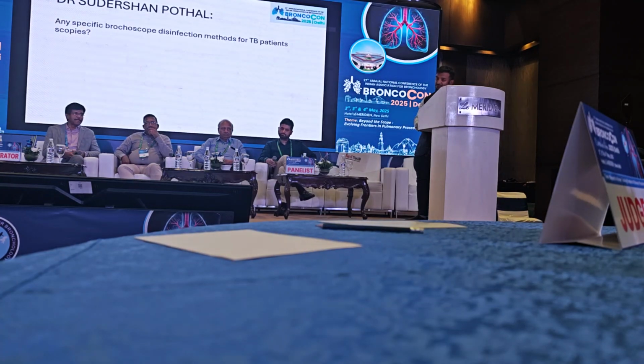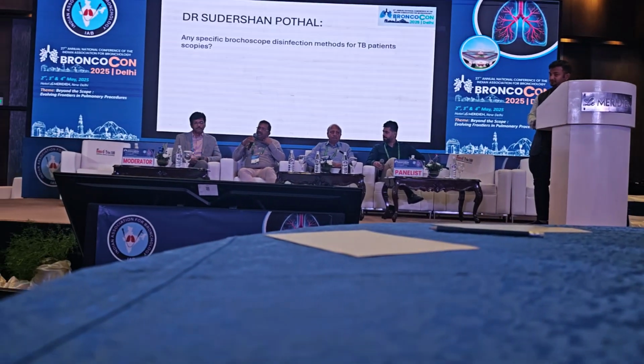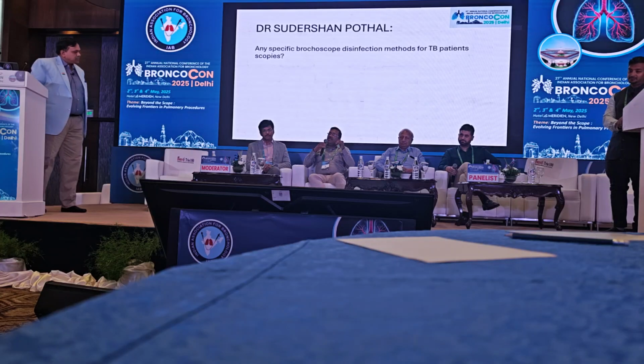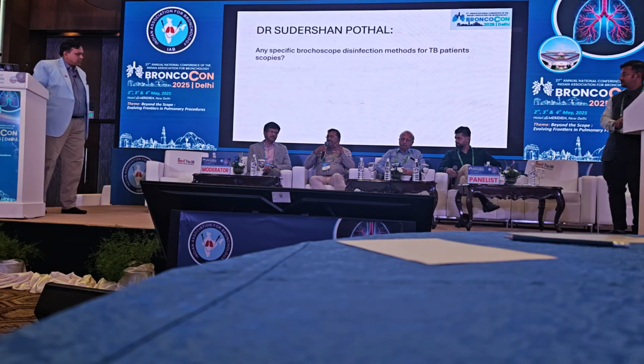That's true, sir. So now we go to Dr. Sudershan again. Any specific bronchoscope disinfection methods, because we know that infection is definitely a risk to the next patient. So what to do for it? Yes, it's very important, because if you are following the standard protocol, it's okay. But still, we have to take into account the disinfectant we are using, particularly glutaraldehyde. It has to be kept at least 20 minutes. That's important. Second, after washing the bronchoscope, ideally it should be kept in 70% alcohol. Those are the two important things, particularly with regard to the bronchoscope.